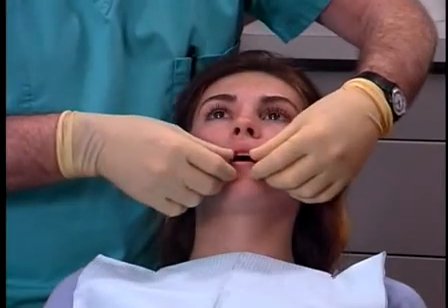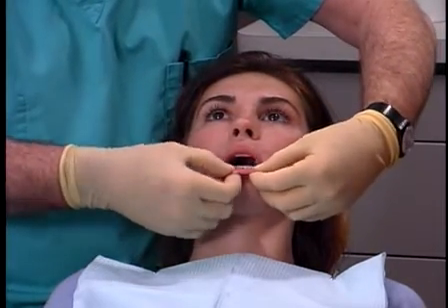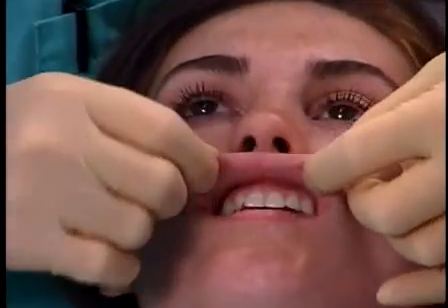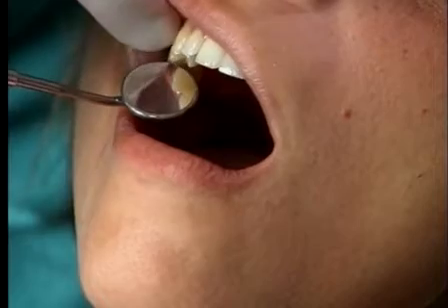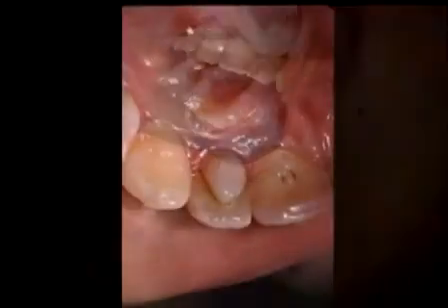A full mouth endodontic examination starts by retracting the lips and taking a good look into the vestibule. By retracting the lips, we can begin to see all aspects of the soft tissue. A mouth mirror is very helpful to look for caries, existing restoratives, microfractures, and any other anomalies that we might not otherwise see.